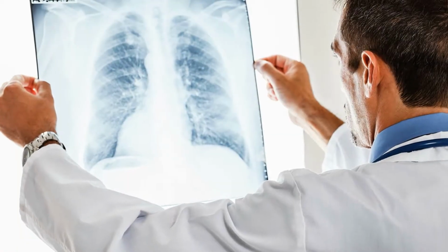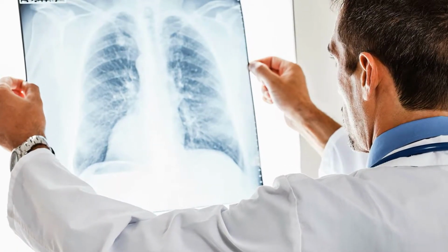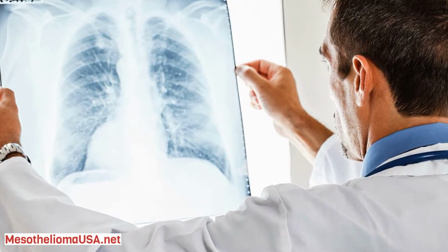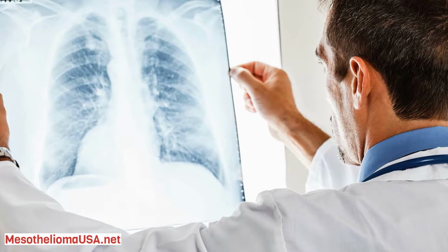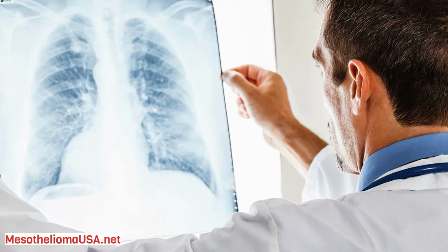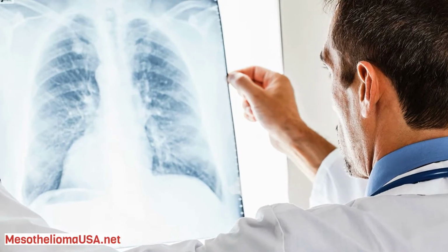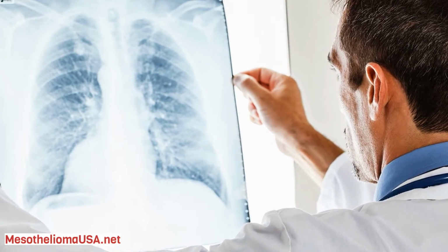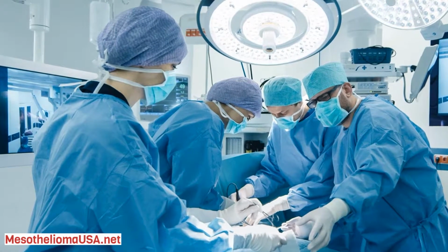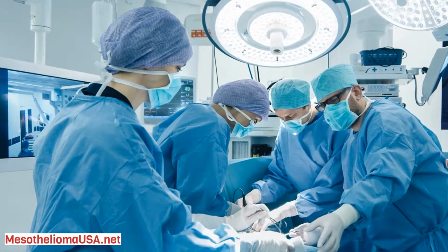Mesothelioma versus Pleural Metastasis Radiology. Background. Malignant pleural mesothelioma, MPM, is a rare malignant neoplasm of the pleura that typically affects individuals occupationally exposed to asbestos through a variety of industries. MPM presents with several CT features similar to more common pleural diseases such as metastatic pleural malignancy.